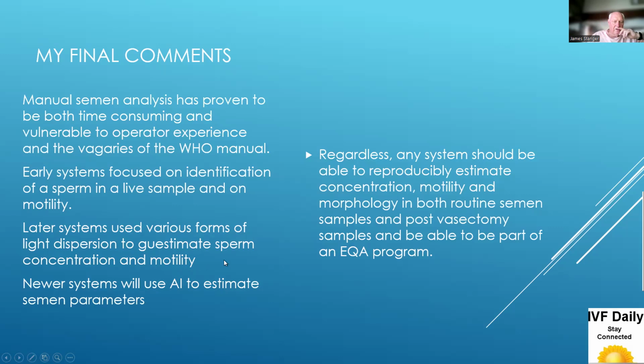Newer systems will undoubtedly use AI to overcome all these parameters. Regardless, any system should be able to reproducibly estimate concentration, motility, and morphology in both routine samples, complicated samples, and post-vasectomy samples, and to be able to be part of an EQA program.